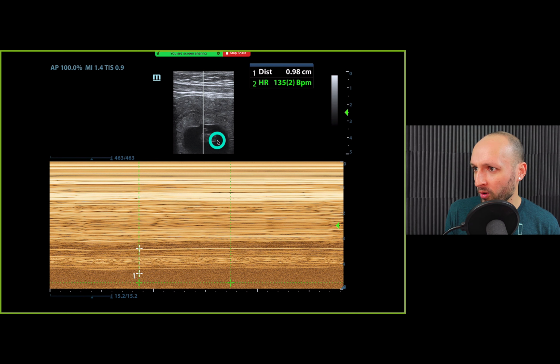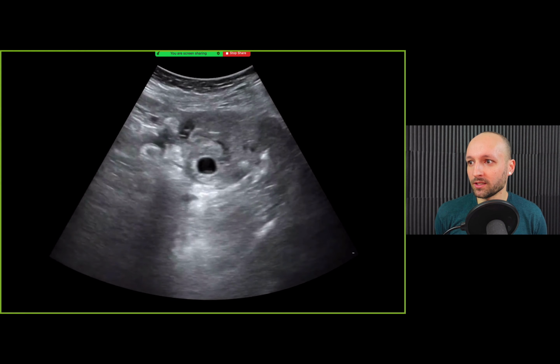It's at about 4 now because I'm pushing on the abdomen to try to get the probe a little bit closer. 4 is right there, and I can see a repeating pattern here, here, here, here, here. And that's how we should check the fetal heart rate. Linear transducer works really well early in pregnancy, as long as you can get the probe to within about 5 centimeters of that fetus. All right, here's another case.